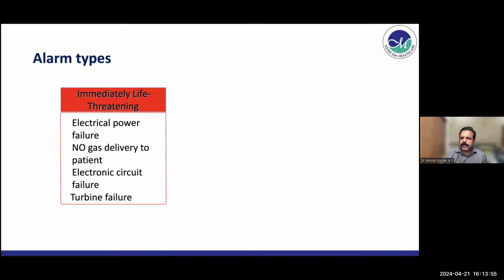If you are working in a good ICU, the central oxygen will have a pressure alarm in the unit that will also alert you that the central pressures are very low. We were very careful about this, especially during the COVID outbreak, in small hospitals where you don't have liquid oxygen and you are using bigger cylinders and the consumption was very high.